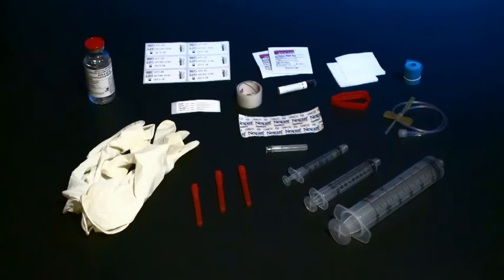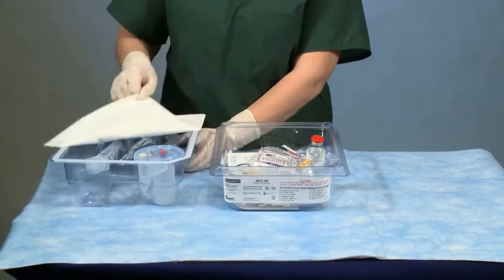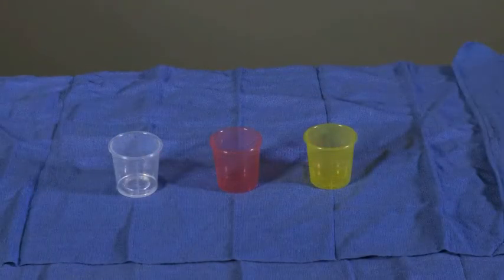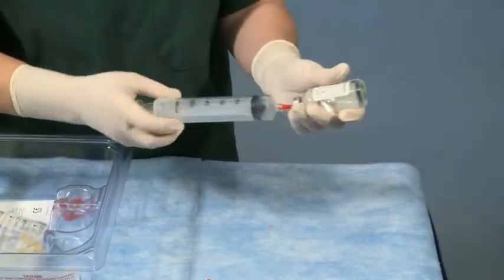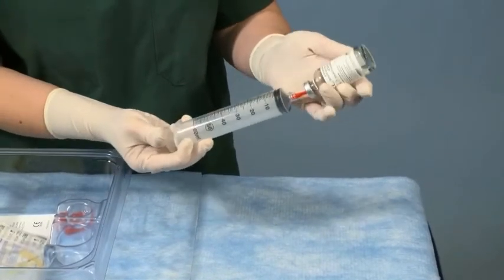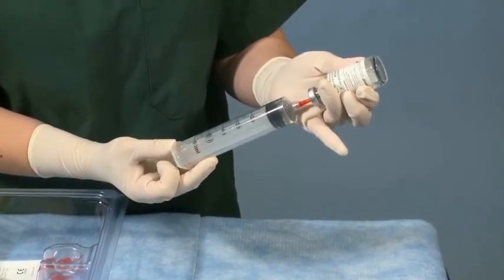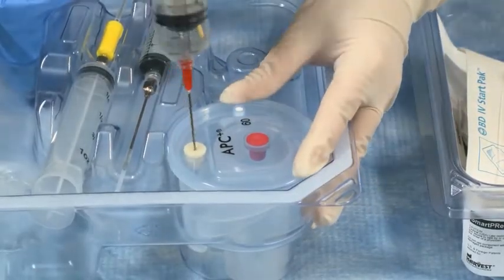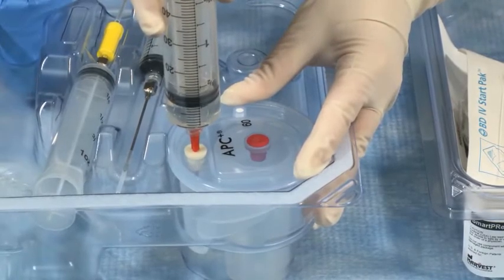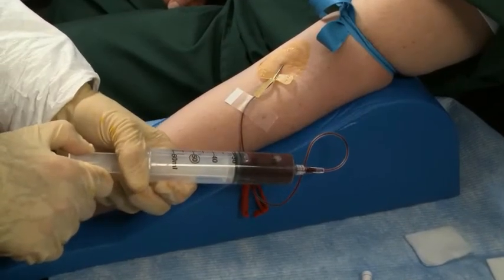Each disposable kit comes with everything necessary to draw and process the patient's blood. You will need gloves from your facility. When the process kit is opened, transfer the wrapped sterile cups to the surgical or sterile field. Load the 60 ml blood draw syringe with 8 ml of ACD. Transfer 2 ml into the plasma side of the process disposable, which is marked by the white port. This ACD in the disposable chamber aids in platelet resuspension. The other 6 ml of ACD remain in the syringe and are used for the patient blood draw.